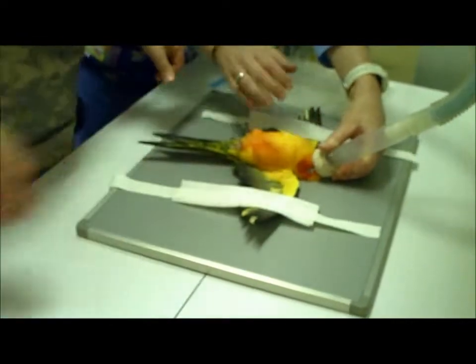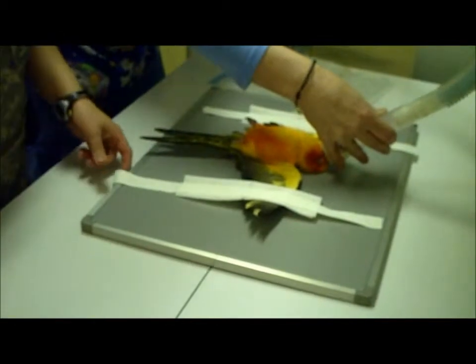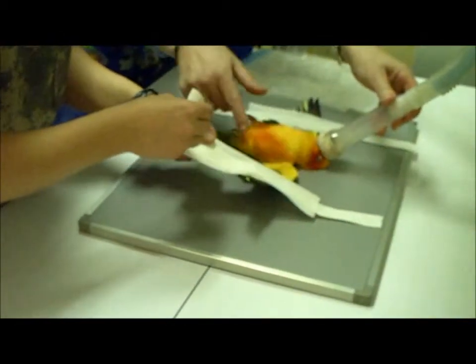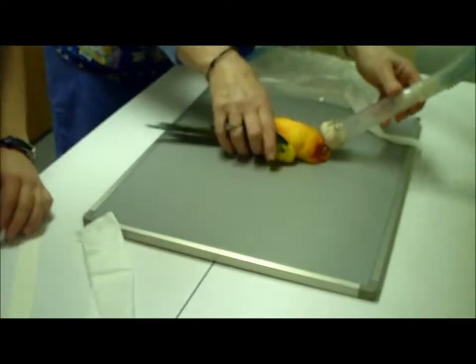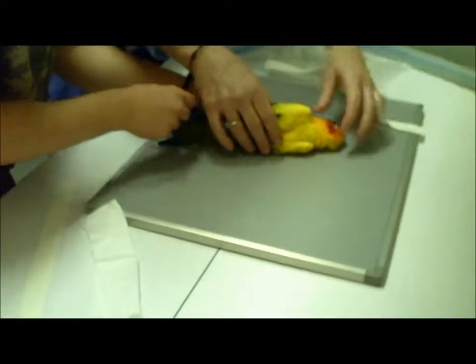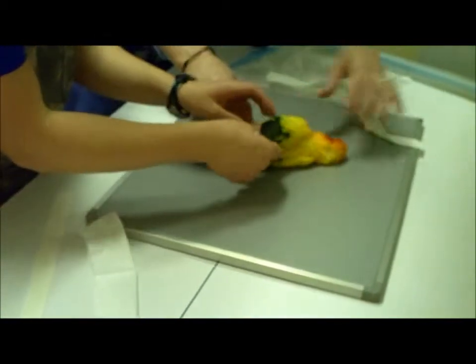To do the ventrodorsal view, we measure at the thickest point in the chest in the VD position and then secure the wings down on each side with tape. A doctor in my practice recommended using gauze underneath of the tape to prevent feather removal at the time that we take the tape off.